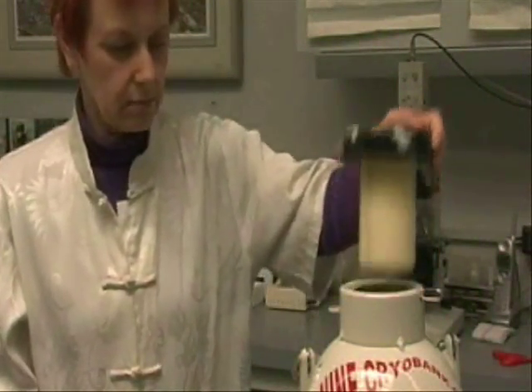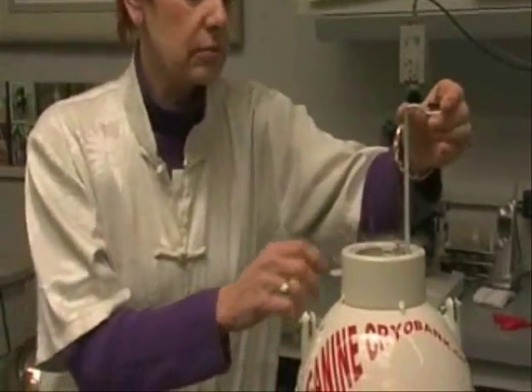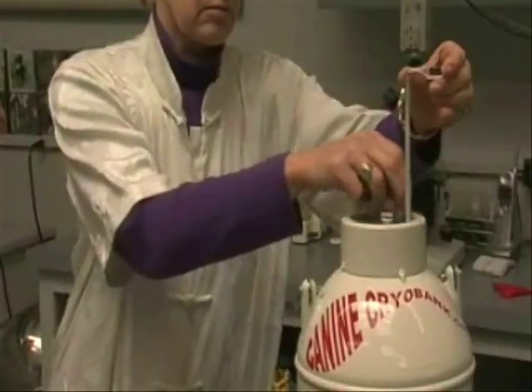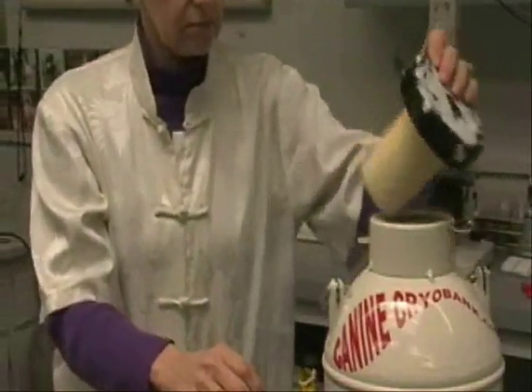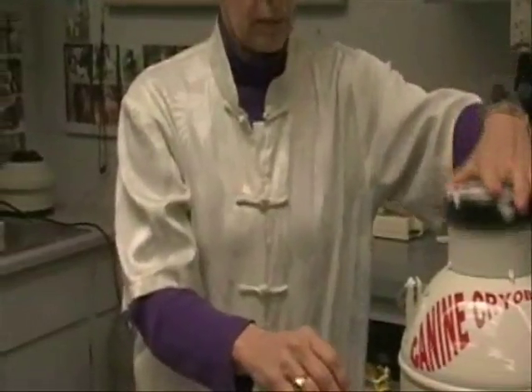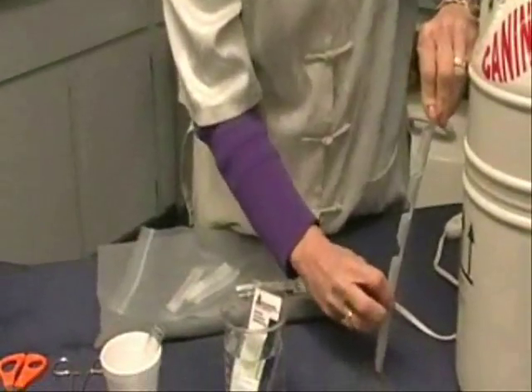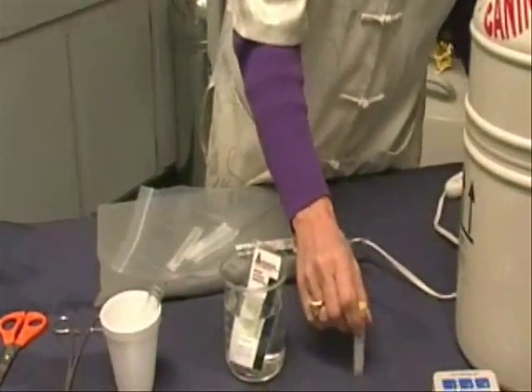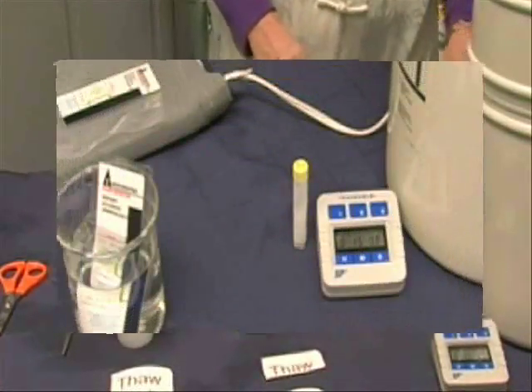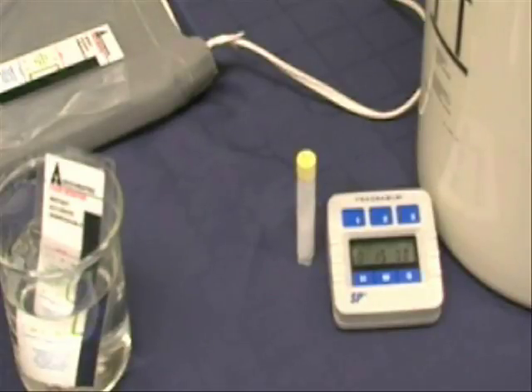Open shipping tank. Locate aluminum cane labeled thaw media. Remove small vial containing thaw media and warm to room temperature. Estimated time to bring media to room temperature is 10 to 15 minutes.